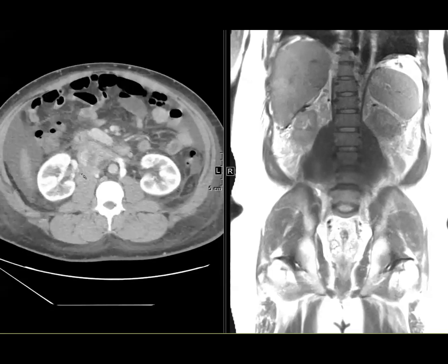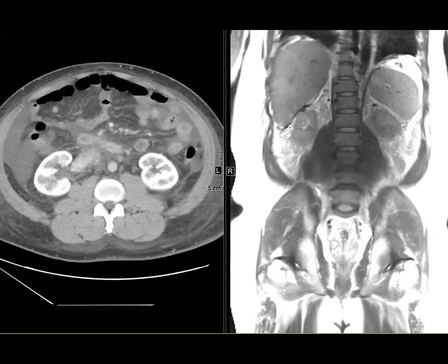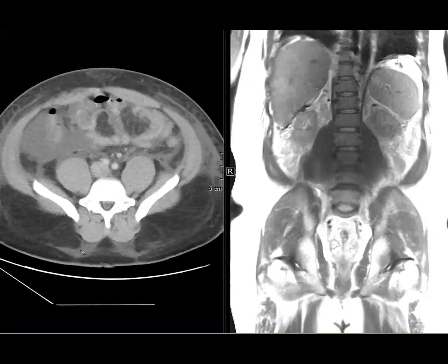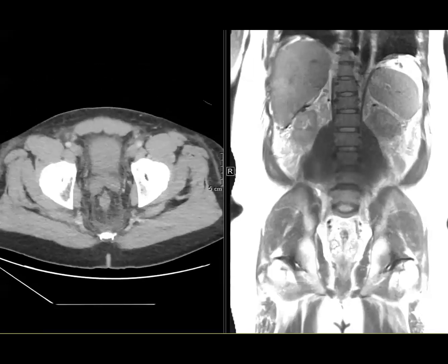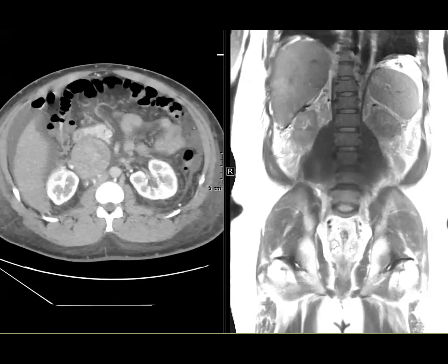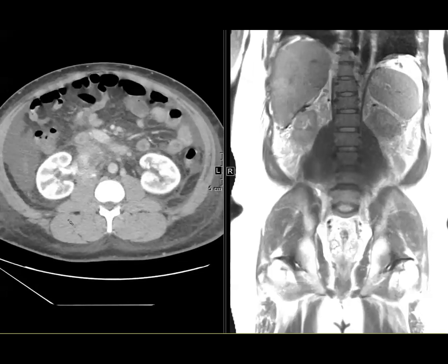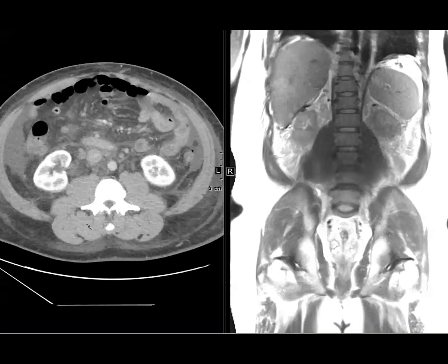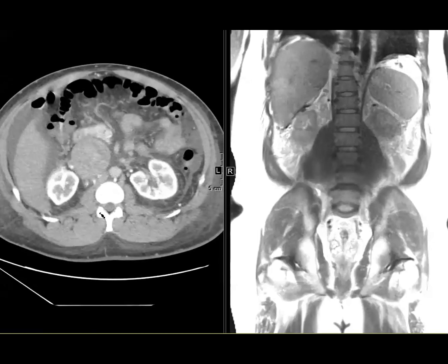Maybe even extending into a lumbar vein here. And then it kind of ends, but there's mottled enhancement below it in the IVC. Not renal, so maybe it's a sarcoma of the... Yeah, exactly. And Swachchhanda said it too. So this was an IVC leiomyosarcoma.